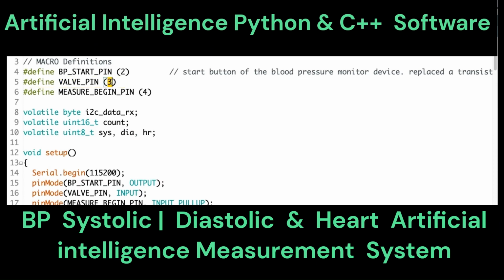to be analyzed to derive an optimal value of the internal pressure of the first part air pocket. After that, the internal pressure on the first part air pocket is set to the optimum value. Finally, the blood pressure of the user is measured as a continuous waveform.